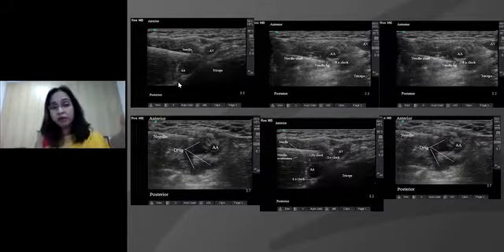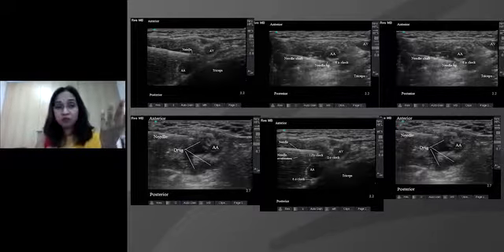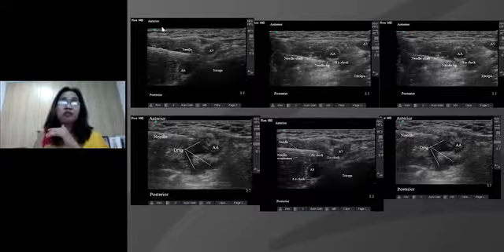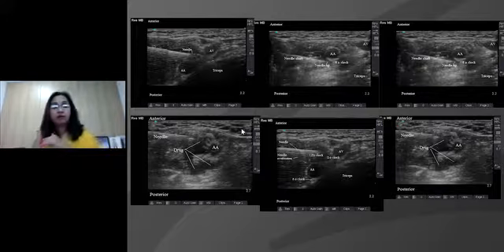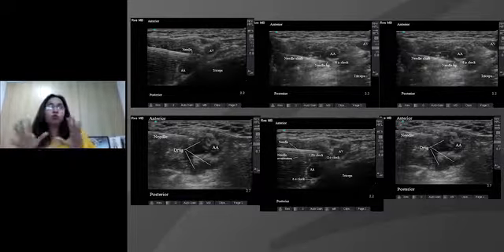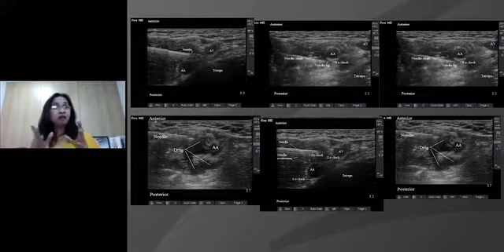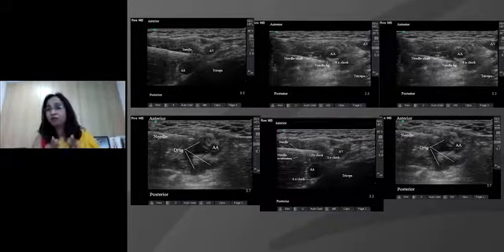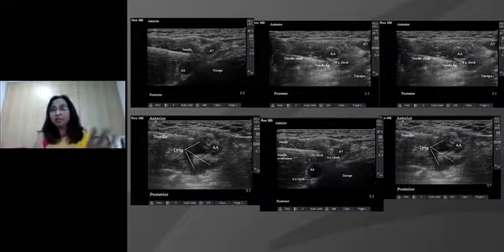If you're very high up in the axilla, you're going to get the latissimus dorsi. If you are slightly in the middle or lower axilla, it's going to be the triceps, and then there is going to be biceps and coracobrachialis, the skin and subcutaneous tissue, and the axillary artery and the axillary vein. Although this is an entry-level block, it needs a lot of skill, because there are two big vessels looking at you all the time, and the nerves are not so discrete. The nerves are there, but they can be very differently placed in this particular block. So if we can master the axillary block to begin with, I think we are ready to give all other blocks as well. This is a very good entry-level block.